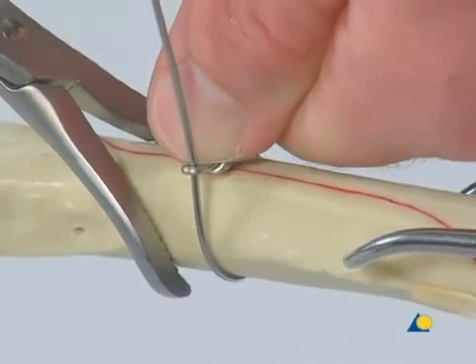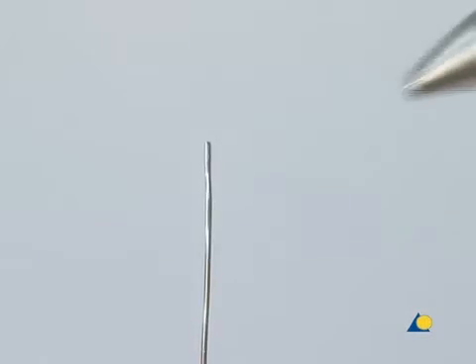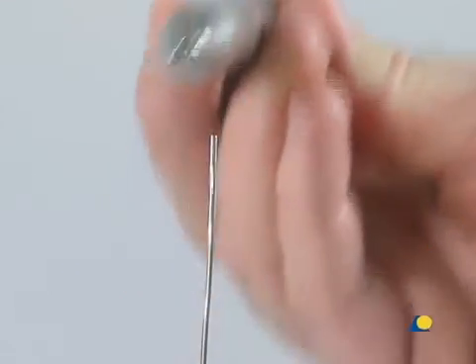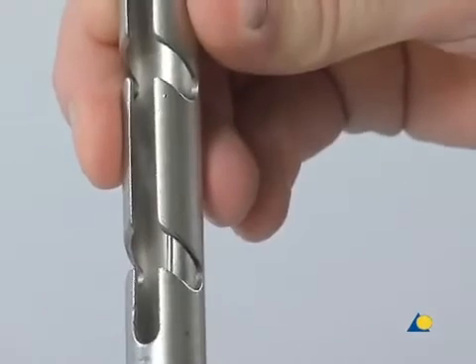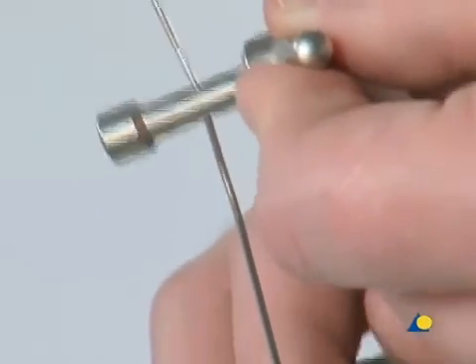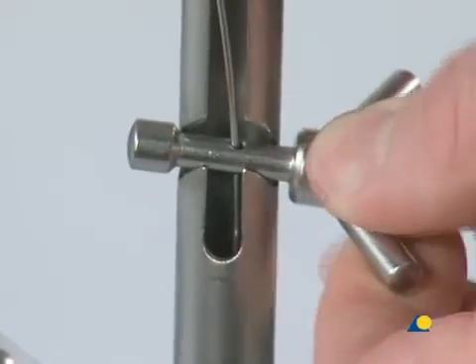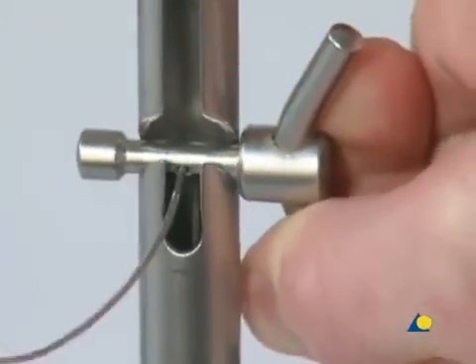In surgery, an instrument would be used — for example, the periosteal elevator. The end of the wire is then passed through the opening in the bottom of the wire tightener, which is slid down to the bone. The wire is passed through the hole in the center of the peg, the peg is positioned in a slot of the wire tightener, given a quarter turn, and the excess wire is trimmed.